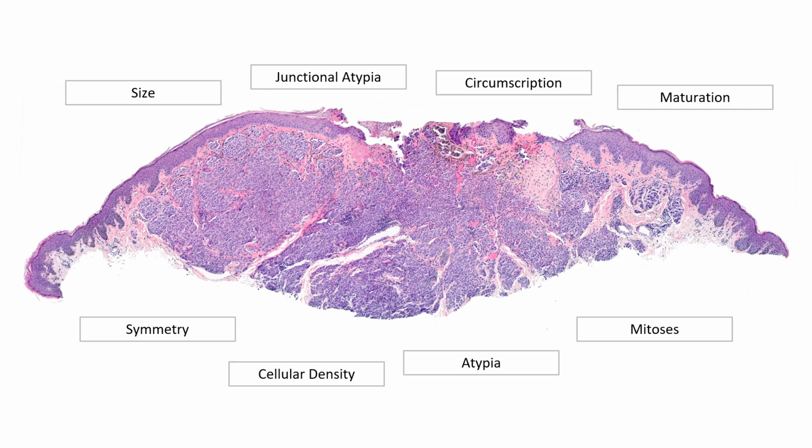But according to many of our study participants, the ulcer was the major complicating factor in this case because it made it difficult to determine whether any atypical features should be taken as evidence of malignancy, or whether they might simply represent reactive changes induced by the ulcer and inflammation.